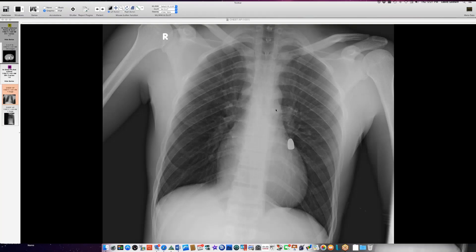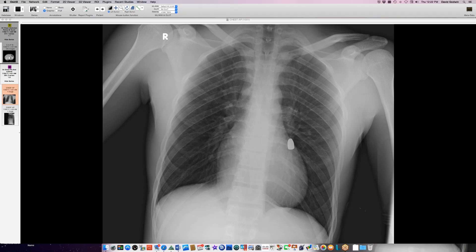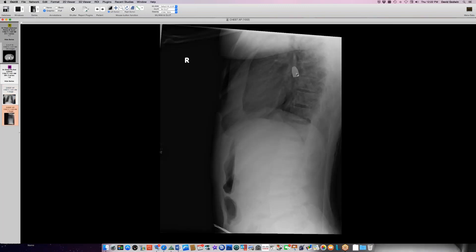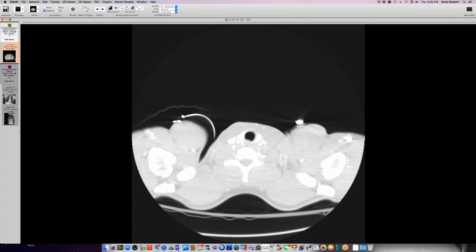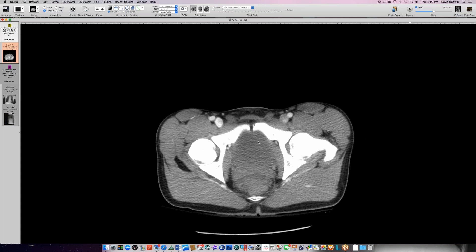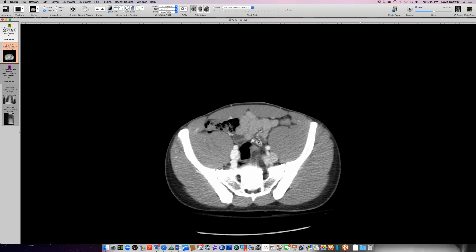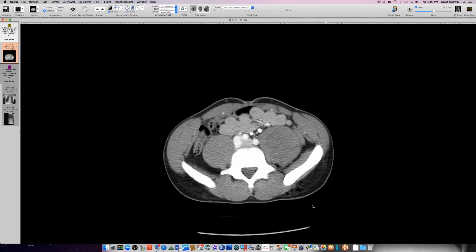This person has a bullet — looks like about a .45 caliber or 9mm size bullet floating around in the chest, and the person doesn't have any chest symptoms at this point. This is an outside radiograph from Alaska where this person was seen. The question is, where did the bullet come from? The person was not shot in the chest. This is a bullet in a proximal lower lobe pulmonary artery — so it's a bullet embolism.